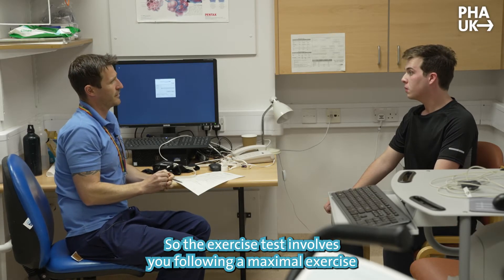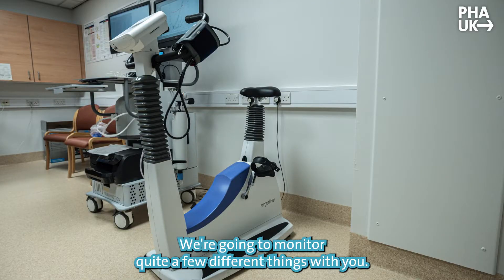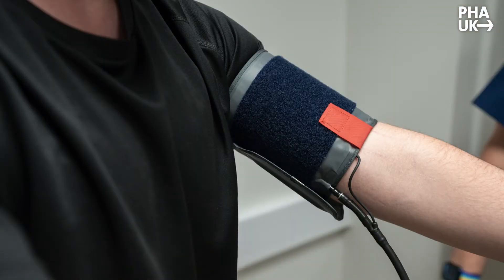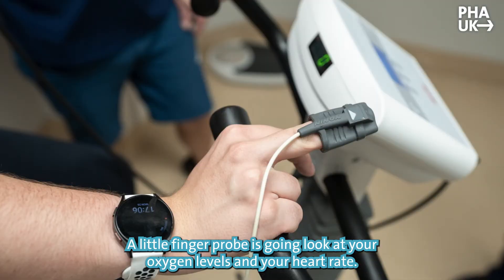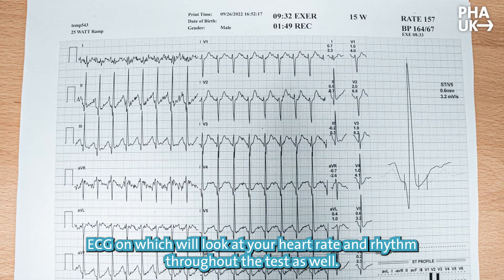So the exercise test involves you performing a maximal exercise test on the bike. We're going to monitor quite a few different things. We're going to have a mask on that's going to monitor your breathing, a blood pressure cuff that's going to go up and down during the test, a little finger probe looking at your oxygen levels and heart rate, and also a 12-lead ECG looking at your heart rate and rhythm throughout the test.